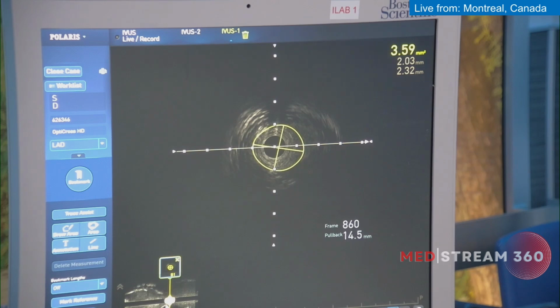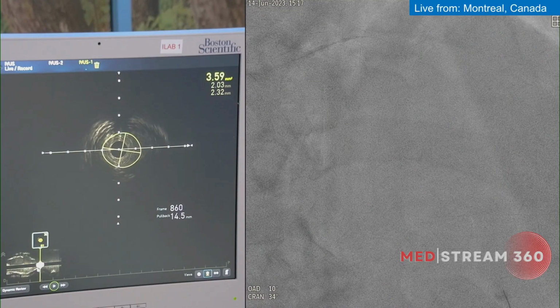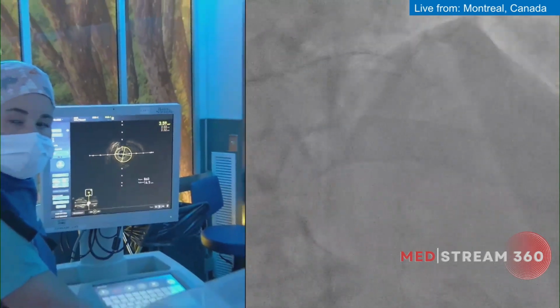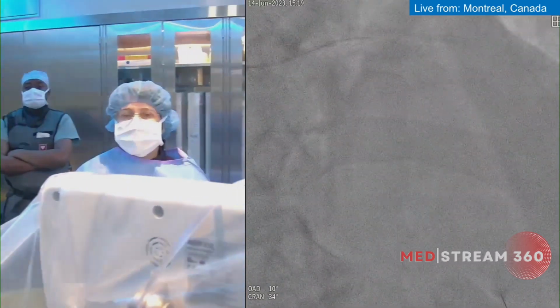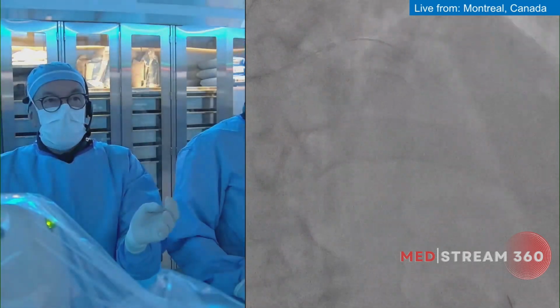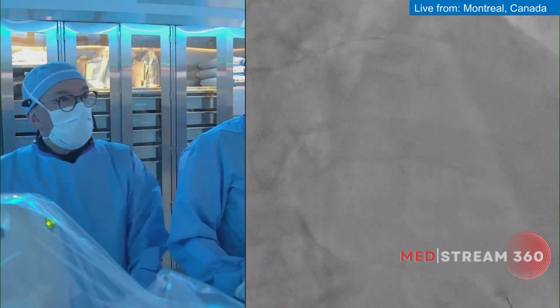What do you think, JF, about the landing zone for the proximal LAD? Again, I was busy setting up, but from the angiogram I think, and now the IVUS is maybe unclear, but we'll do it after the orbital atherectomy to find out. I thought there was a good landing zone in the ostial proximal LAD without going to the left main. But we'll see with the IVUS. So we're working live now.